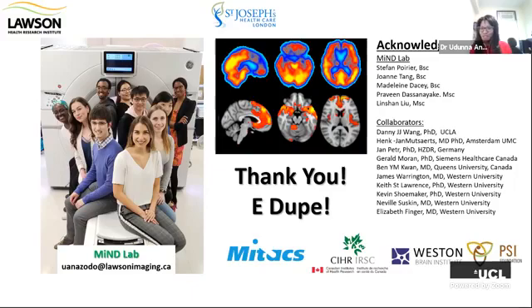A lot of the research that we've done in ASL in the past 10 years have been on 3 Tesla scanners because it's easier to acquire the images, it's faster. This is where you can play a lot with your parameters. So if you were to read ASL papers, you find a lot of them is actually done on 3 Tesla scanners. But the scanners that we have in Africa, as long as they are at least 1.5 Tesla, they are ready. It's just more or less getting somebody on the ground to be able to optimize the parameters.